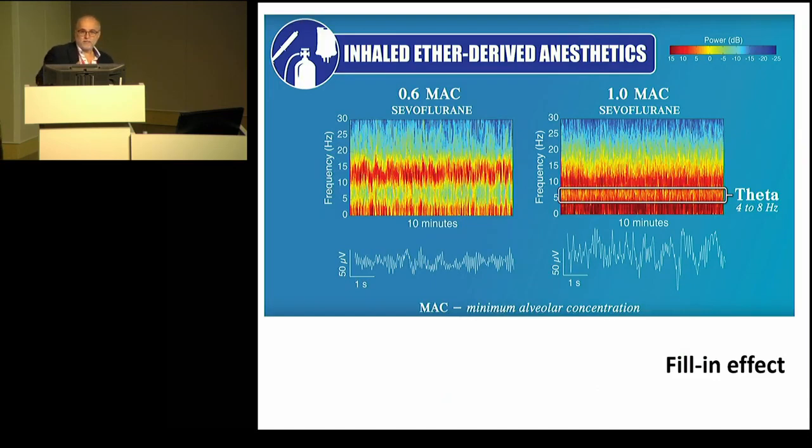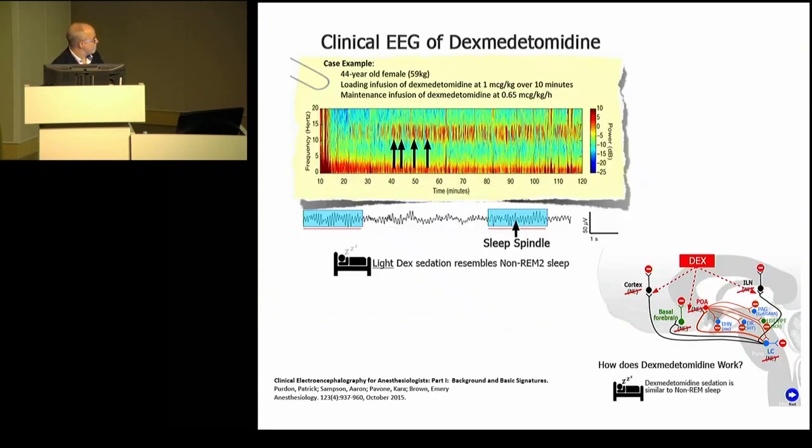Of course, this is similar, but not exactly the same with other anesthetics. For example, that would be with inhaled anesthetics. With low concentration, it looks very similar to the propofol, but if you increase the MAC, then you have this effect here. This is the appearance of theta waves here, what we call the filling effect. So there is something that fills in between the alpha and the delta. This is very typical from deep anesthesia, sevoflurane.